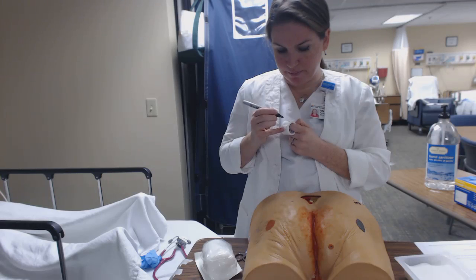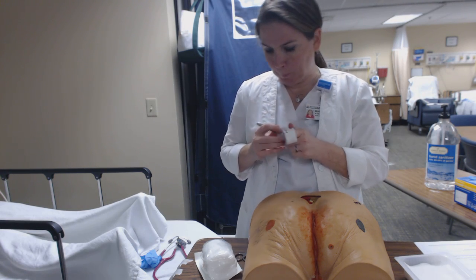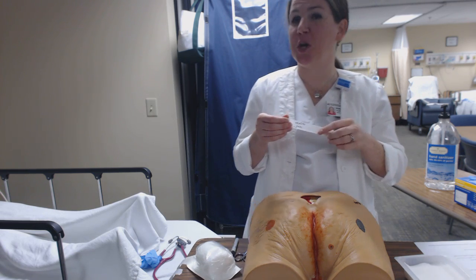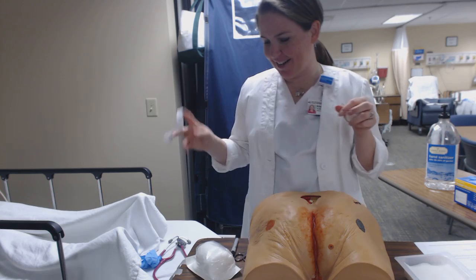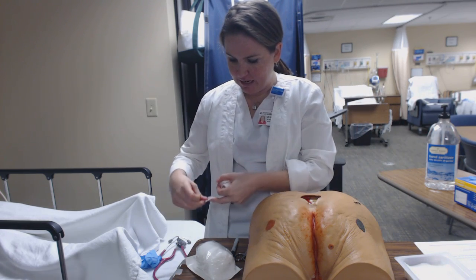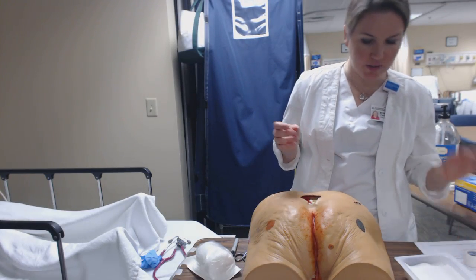In military time. Oh, that military time is tricky. You can get it, just add 12 to whatever time it is. So I've got my label here. So now I have everything ready as far as that goes.